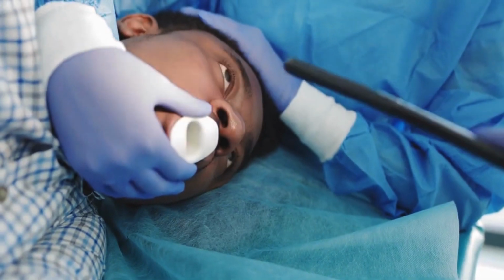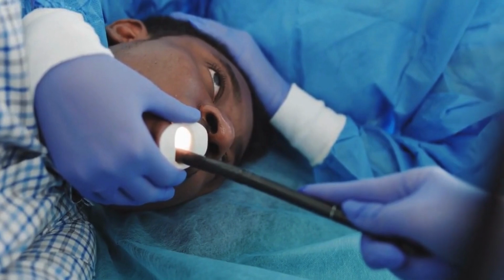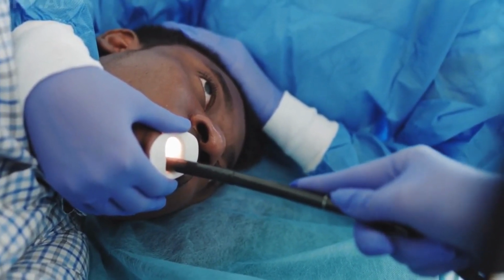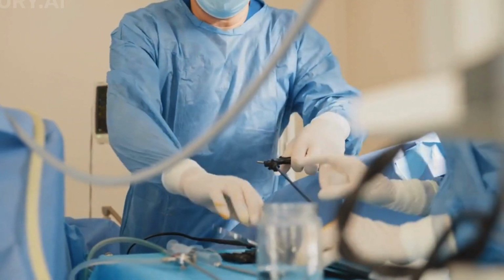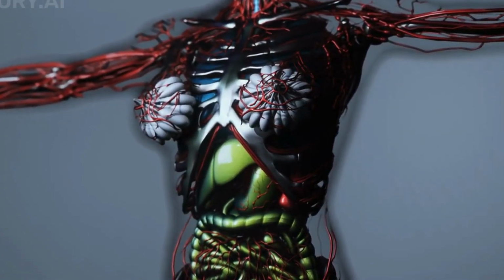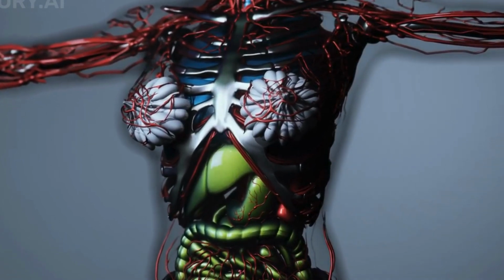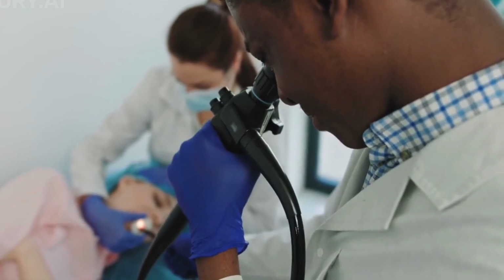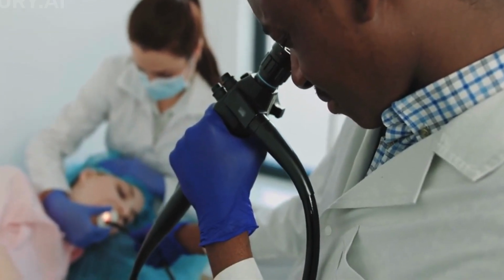3. Insertion of the endoscope. The endoscope is gently inserted into the body through a natural opening, such as the mouth, for upper endoscopy, or the rectum, for colonoscopy. For procedures like laparoscopy, small incisions are made to insert the endoscope. 4. Visualization and intervention. The camera at the tip of the endoscope transmits images to a monitor, allowing the doctor to visualize the internal organs. If necessary, tools can be passed through the endoscope to take biopsies or perform interventions like polyp removal.